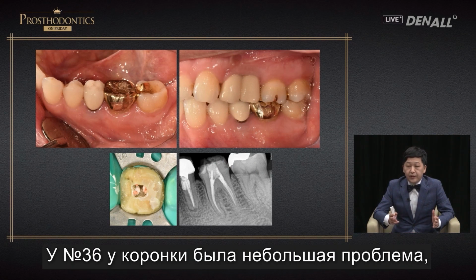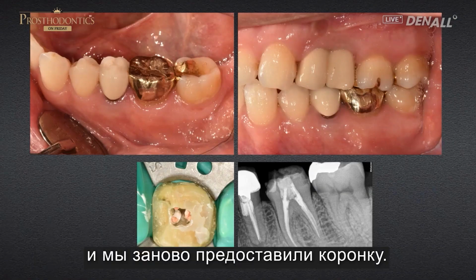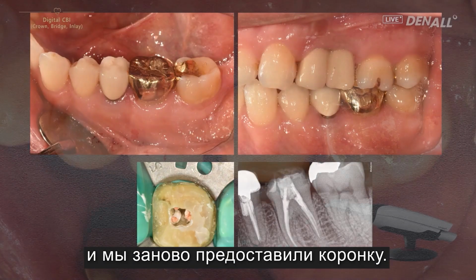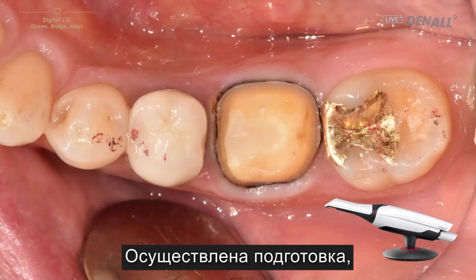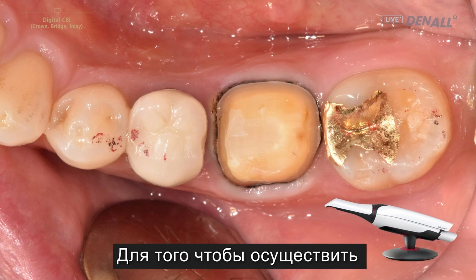In number 36, the crown had a little bit of a problem, so endodontic treatment was done and crown was provided once again. Prep was done. 3-0 cord was placed to do oral scan.